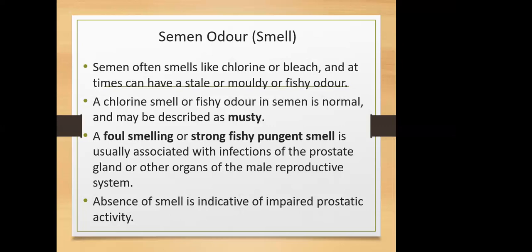So all of us are matured and we have a scent of what semen smells of. Now, that characteristic fishy smell is described as musty, M-U-S-T-Y. So if you have to report on the smell, and for that matter odor, of semen, use the word musty.